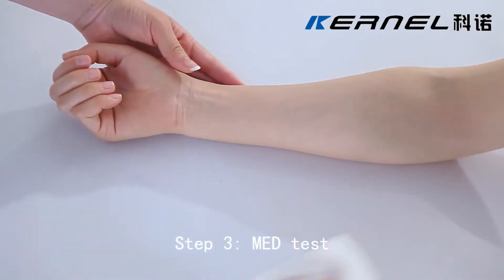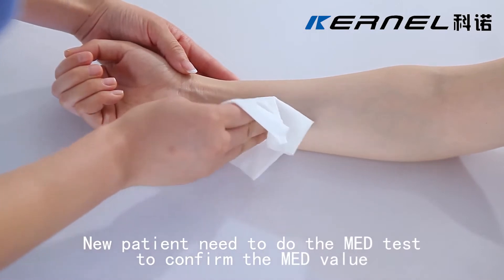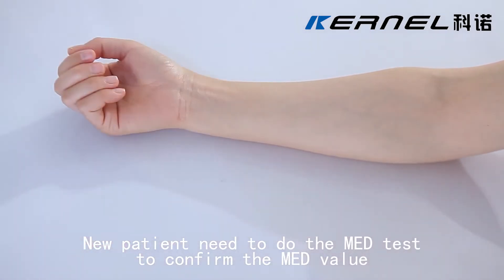Step 3: MED test. New patients need to do the MED test to confirm the MED value.